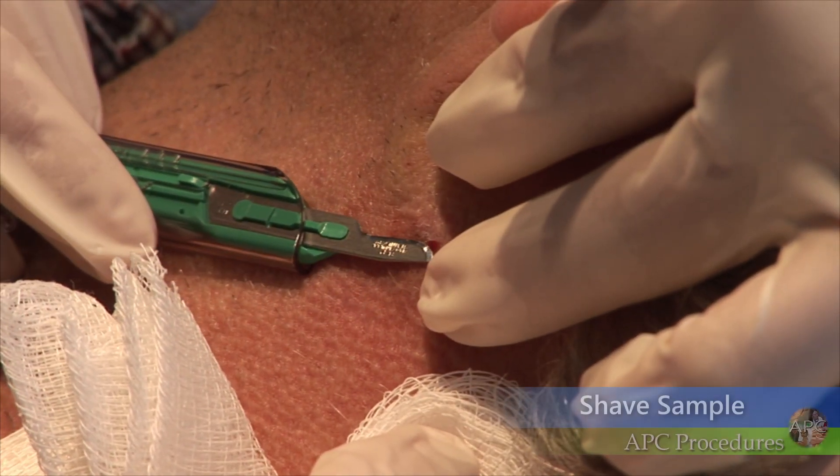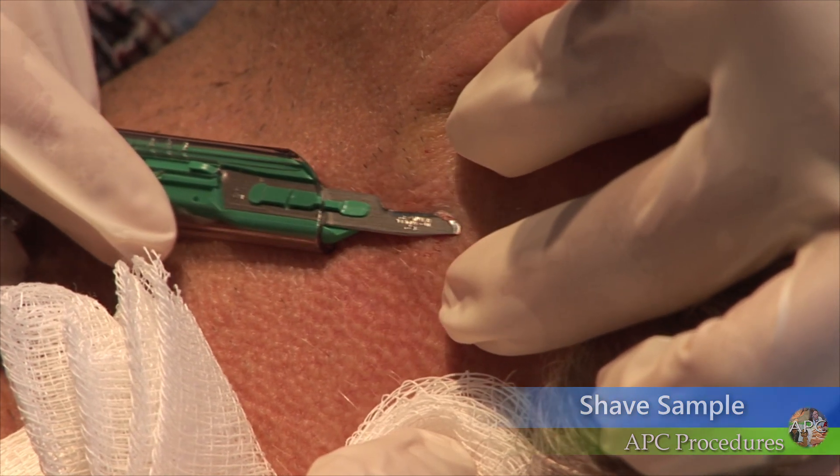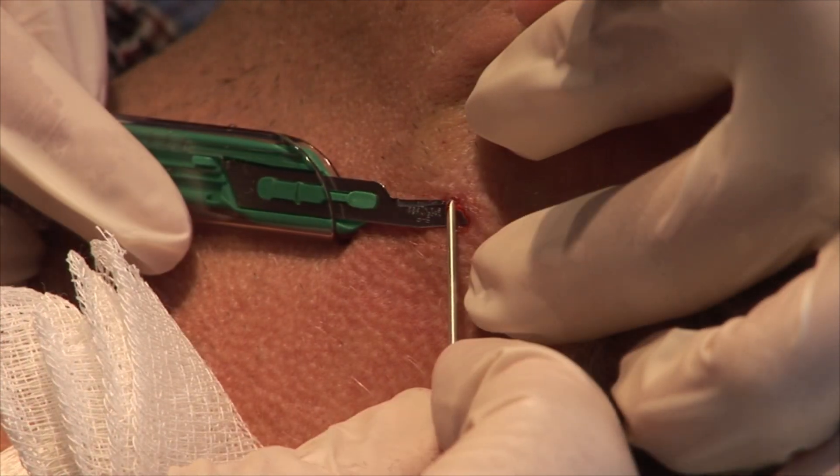Suspicious lesions can be confirmed with either a shave biopsy or a punch biopsy prior to the procedure, or a shave biopsy can be performed as the first step of the curettage and cautery procedure.